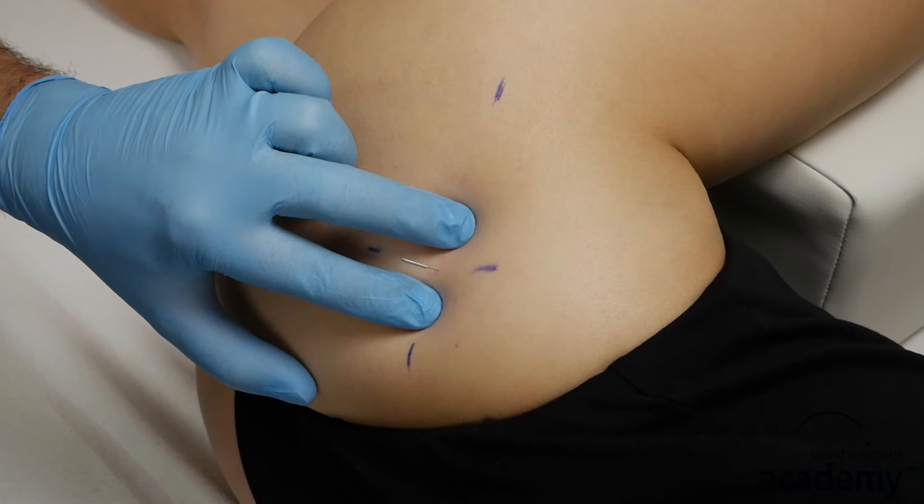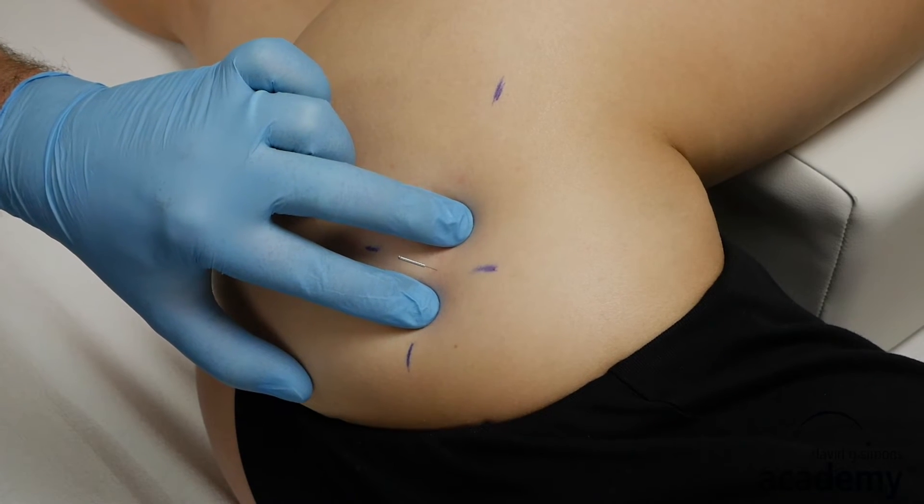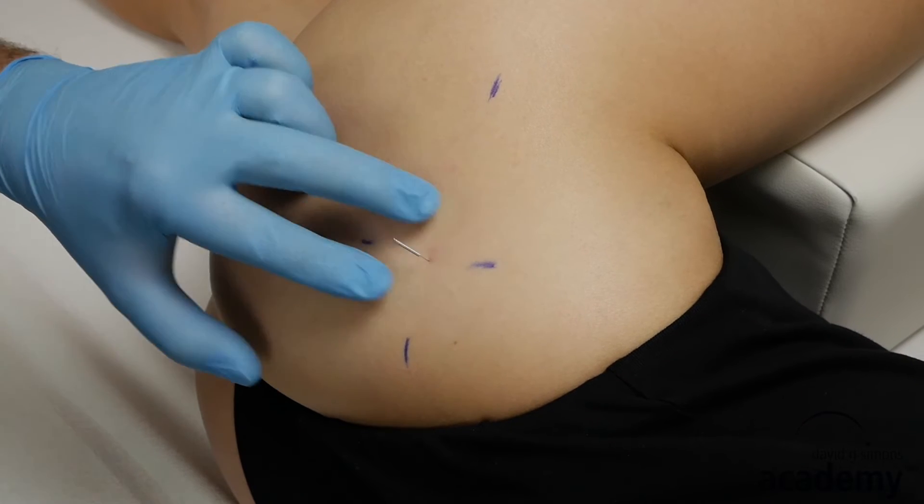Be sure to use full metal needles. Place the second needle into the taut band — if possible into the same taut band as the first needle. Remember not to re-palpate the taut band after the first needle has been inserted.